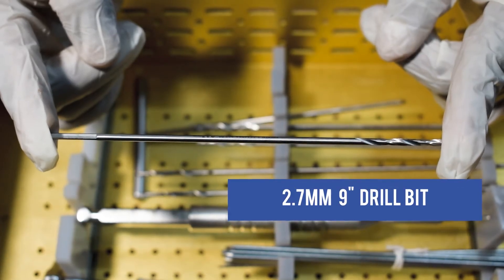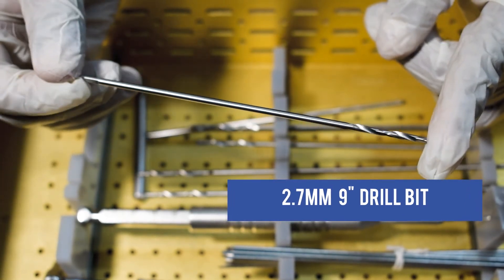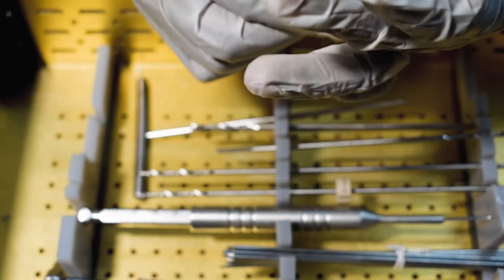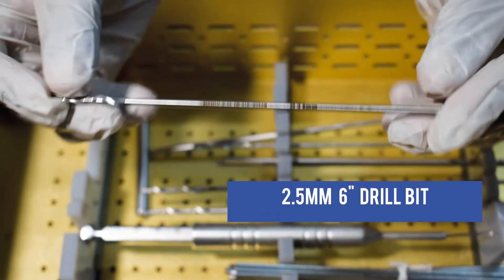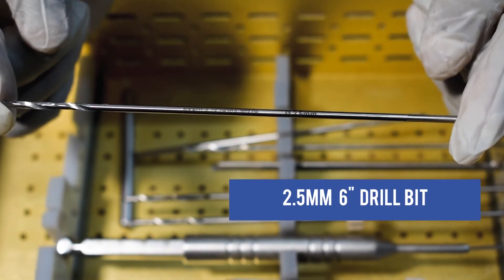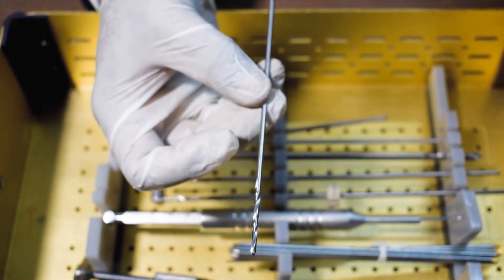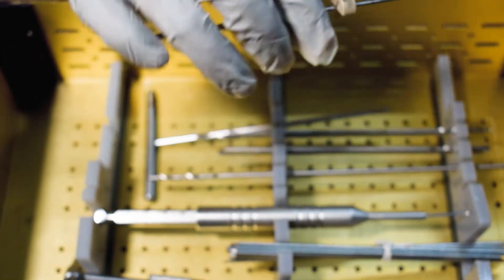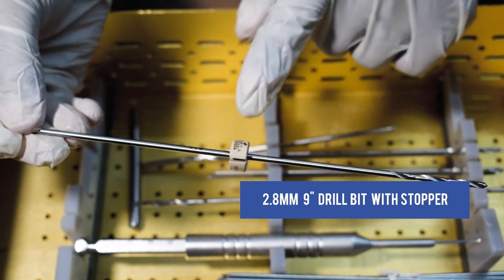This is a 2.7mm 9-inch Drill Bit. This is a 2.5mm 6-inch Drill Bit. This is a 2.5mm 9-inch Drill Bit with Stopper.